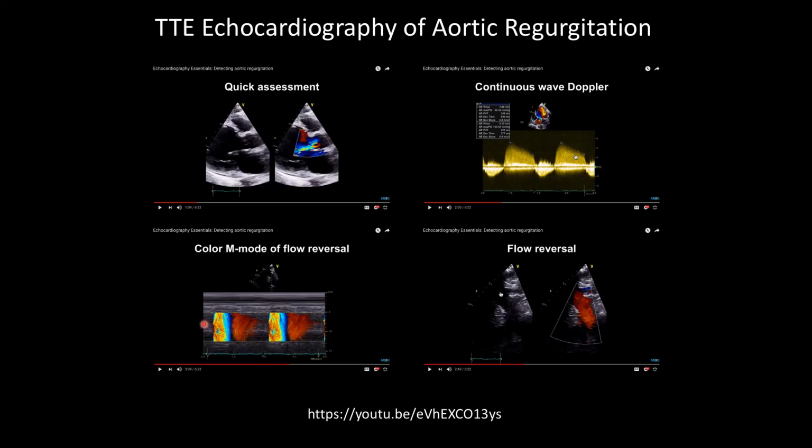And so you can measure, this is one of those B mode scans versus time. So it's like an M mode Doppler. And if you do that right down the middle here, you can see the peak velocity of the ejection and then this long decay of negative velocity going back to the heart. So there's lots you can measure, right?